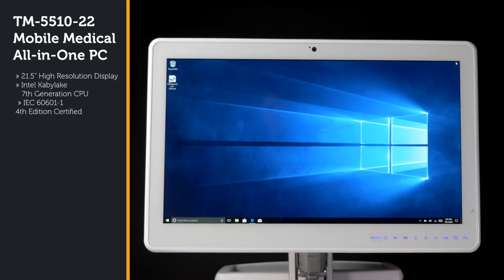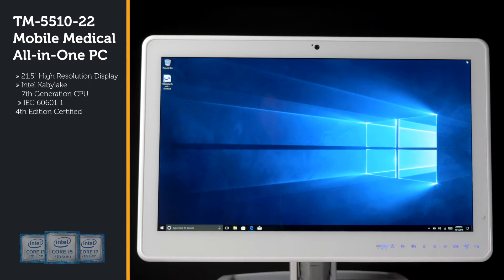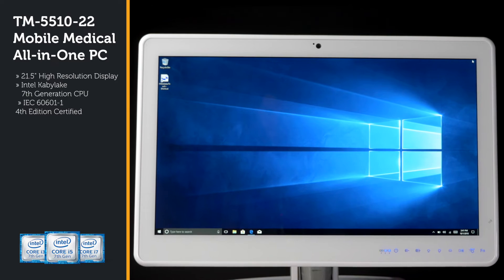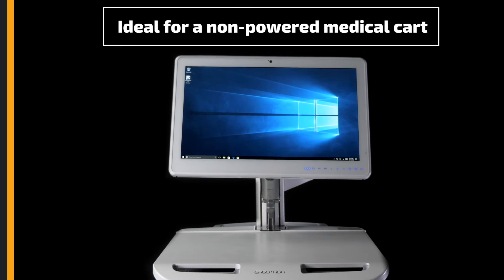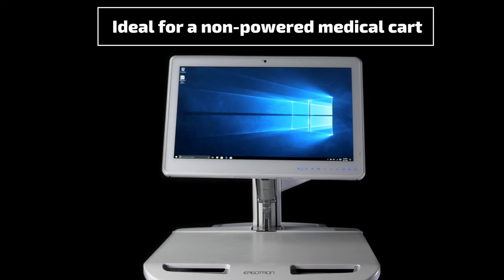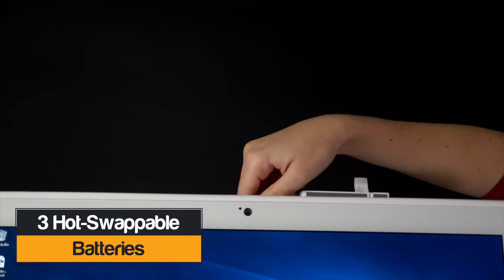The TM551022 Mobile Medical All-in-One PC has a 21.5-inch high-resolution display with Intel Kaby Lake 7th generation CPU. It never needs to be plugged into the wall, as it has three hot swappable batteries that can power the PC for a whole shift of about nine hours.